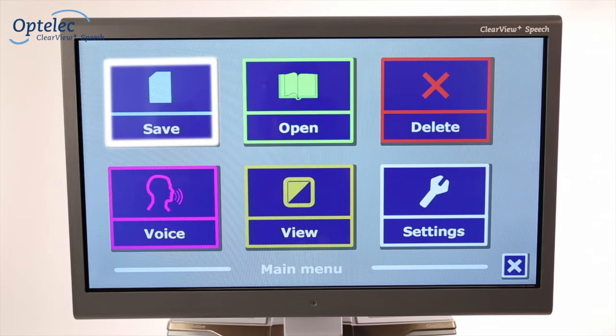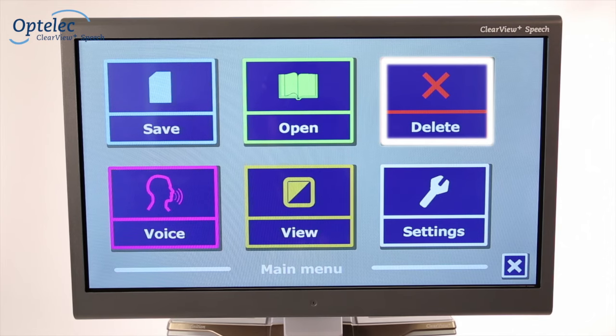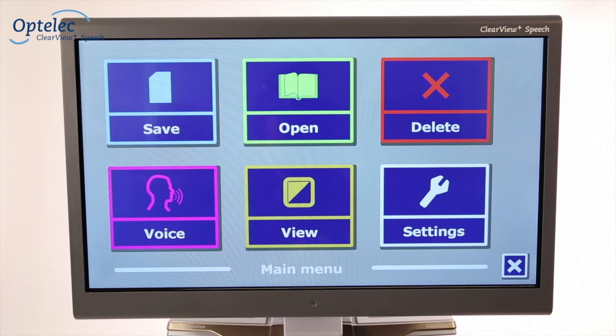The menu allows you to save documents, open documents and photos, remove documents, select a different voice, adjust the colour of the text and change the general settings.